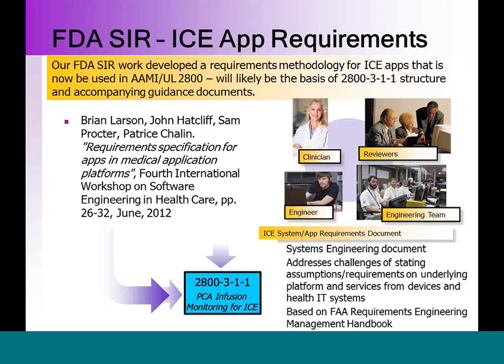So, Paul, you could probably speak to this or confirm this, but there's a lot of battling in the interoperability space right now, where some vendors want to push ahead with very lax regulatory scrutiny and standards applied. But something like this architecture, we've even done this. You can implement the ICE architecture on a phone, and use that to partition your apps on the phone. And you could do the same thing with your home health network hub, and it would be very applicable there.